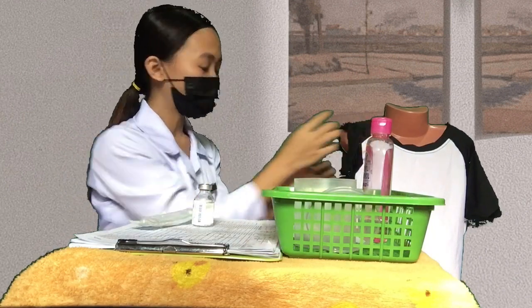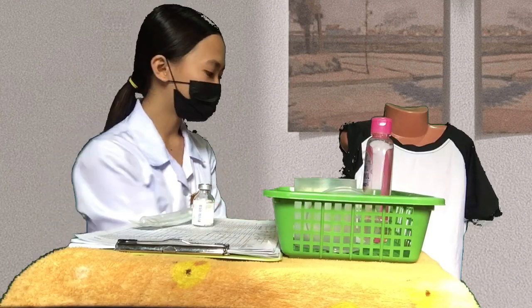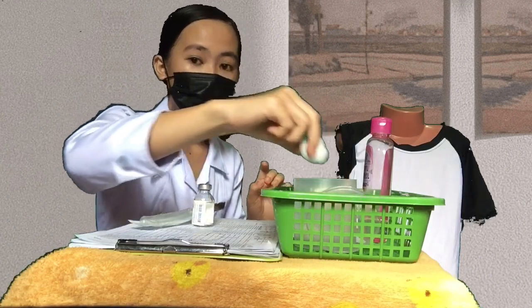Then after that I'm going to don gloves. So assuming that I am already wearing gloves. And then after that I'm going to help her position in an appropriate position. Okay? Then after that I'm going to clean the site using a cotton ball with an antiseptic solution. In a circular motion, I'm going to clean the area and then discard. And then let the skin dry.